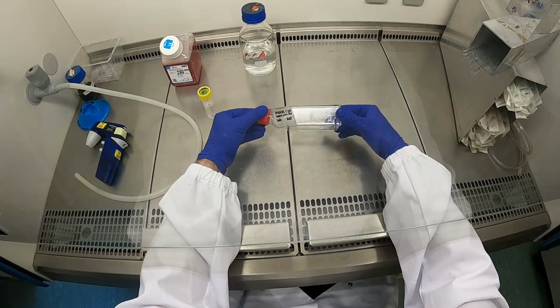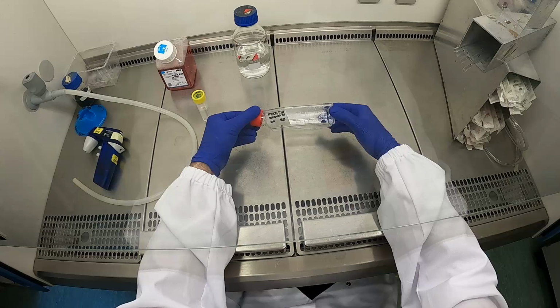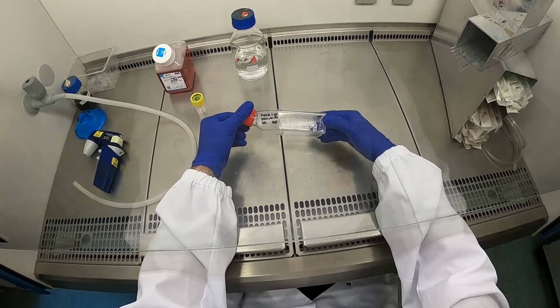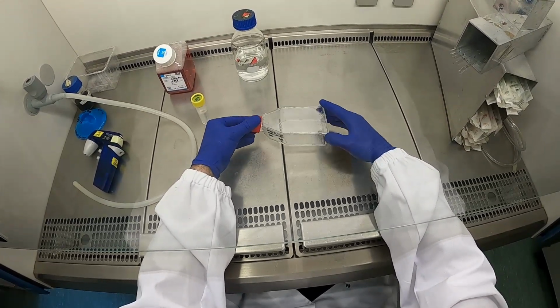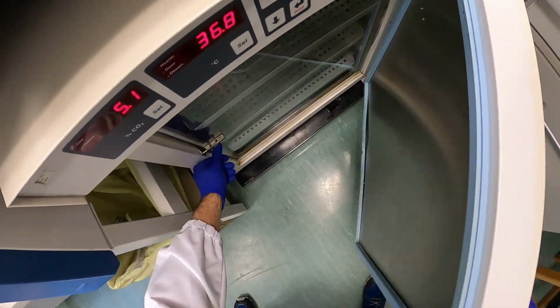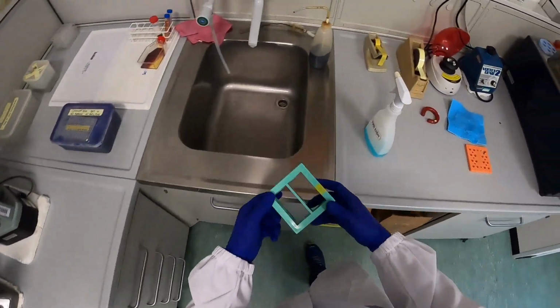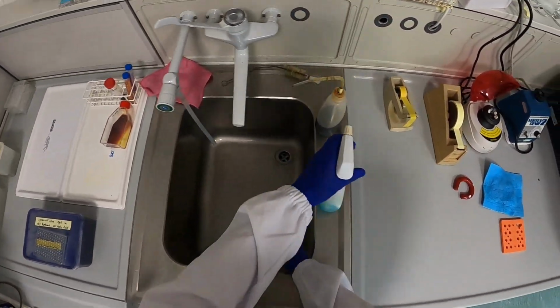This will immediately start cleaving proteins, among which the ones that are used to anchor the cells to the plastic of the flask. Make sure all areas are covered by the trypsin, and then just place it back into the incubator, where at 37 the trypsin will be most active. Wait 5 minutes. Prepare a little bit the things that you need for when the trypsinization is done. So for instance, take this rack, clean it a little bit.